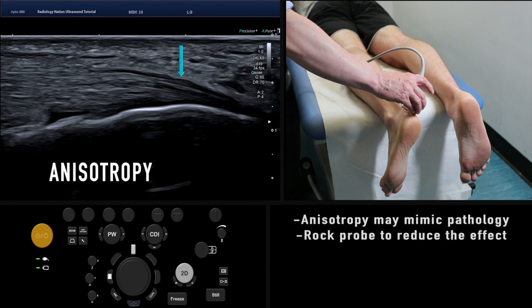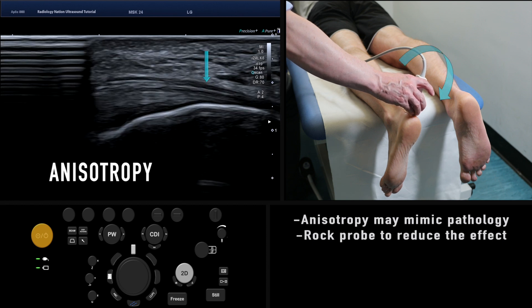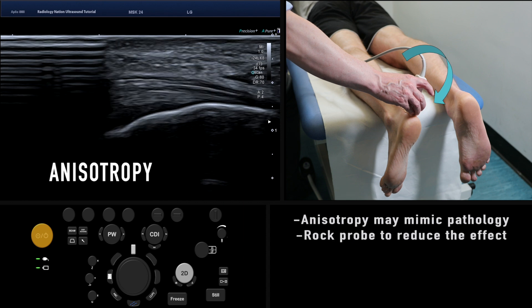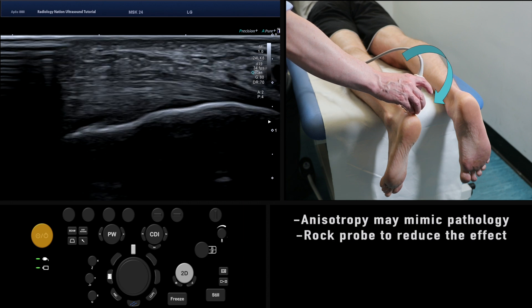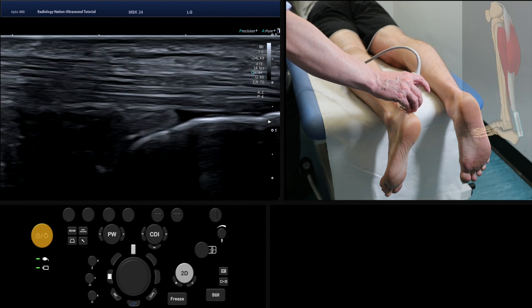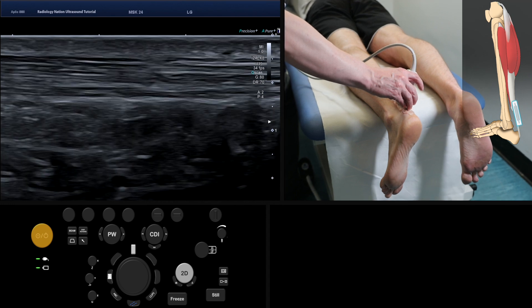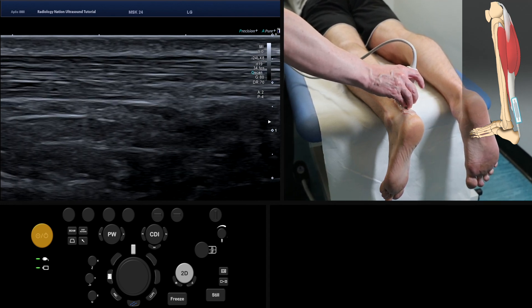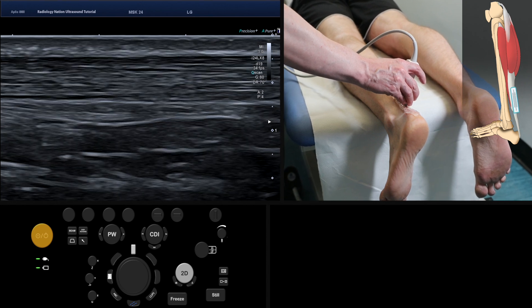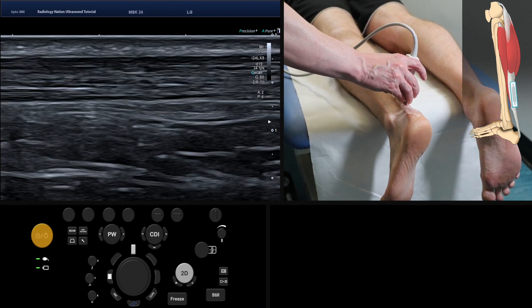At the point of insertion you may see the effect of anisotropy, where a section of the tendon appears hypoechoic. This happens when the target tissue is at an angle relative to the ultrasound probe — the sound waves are reflected away from the probe and the tissue appears falsely hypoechoic. Rocking the heel of the probe alters the angle to the tendon fibres and eliminates this effect. Anisotropy may commonly mimic tendon rupture, so it's important to be aware of this artefact.